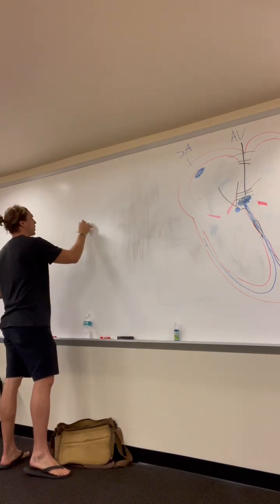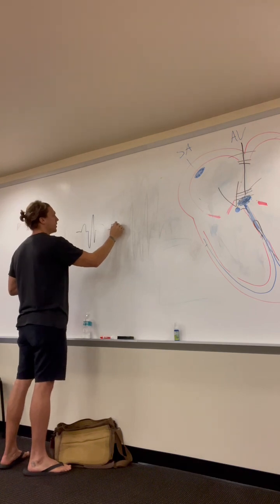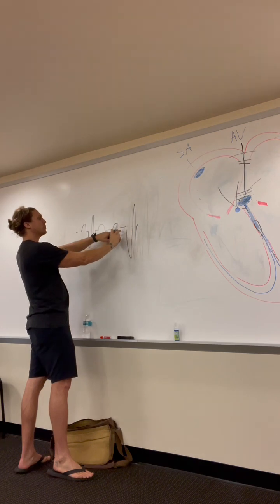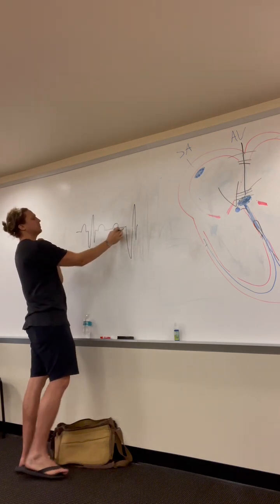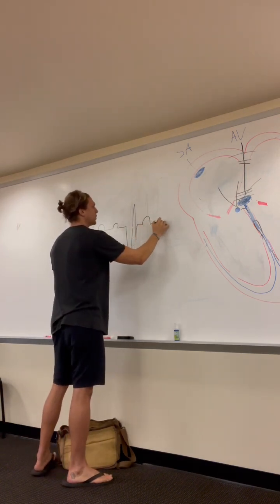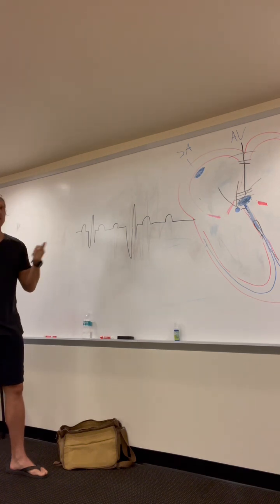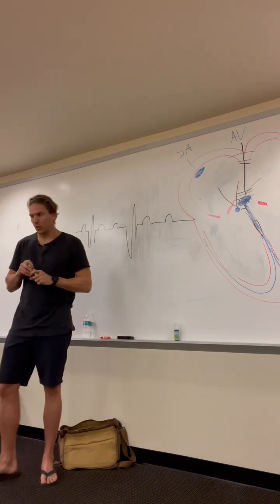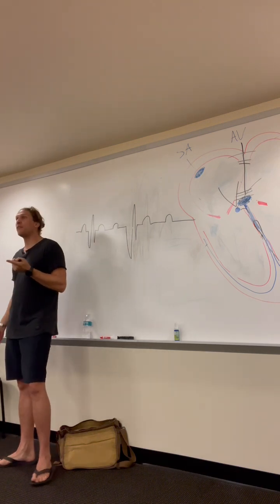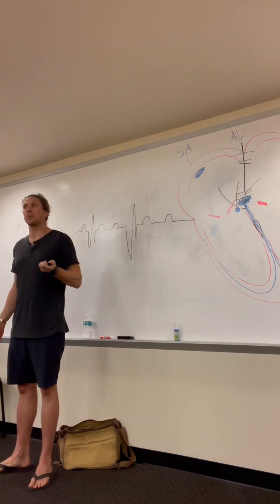So you start out really close, and then it gets a little bit further away from the QRS. PR interval gets longer, and then eventually you'll drop a QRS, and then you'll start all over with another P, okay? So let's go through it systematically. Rate, 5, 50, if it's a 6-second strip. That's your first hint that it might be a heart block, is it's a bradycardic rhythm.